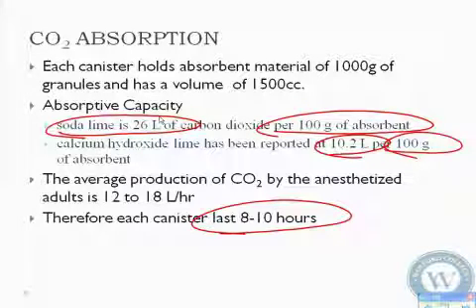The reality is we don't run it at low flows for 10 hours because we don't do anesthesia for 10 hours straight. I've never done a case that's longer than 4 or 5 hours. Surgeries are fast anymore. So you're going to provide high flow at the beginning and high flow at the end. That bypasses the system, so it doesn't even count. Low flow is when it's going to go into your CO2 absorber. But at 8 to 10 hours under full general anesthesia at low flows, that's when you're going to see exhaustion of the CO2 absorbent in about 10 hours.